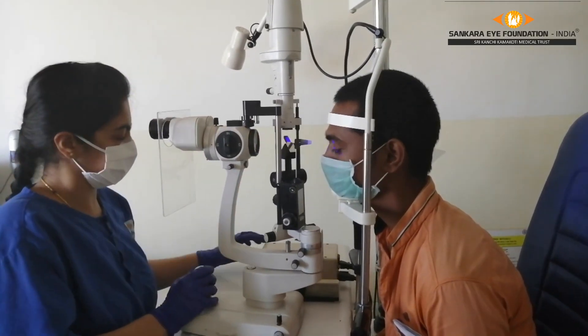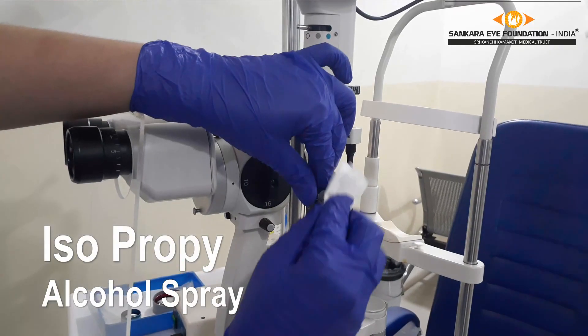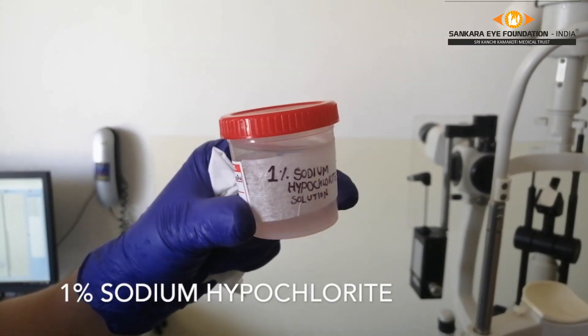After taking the patient's intraocular pressure, the isopropyl alcohol is sprayed again on the applanation tonometer and it is cleaned. This process is repeated for every patient.